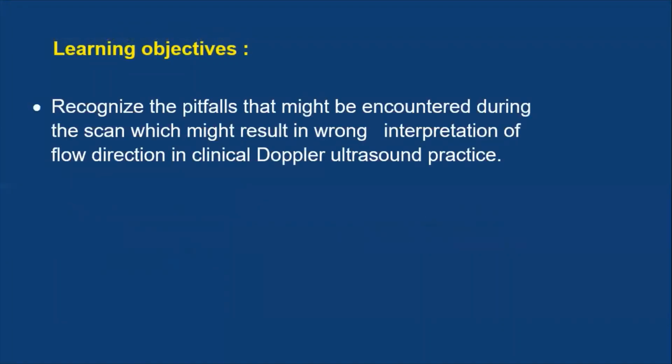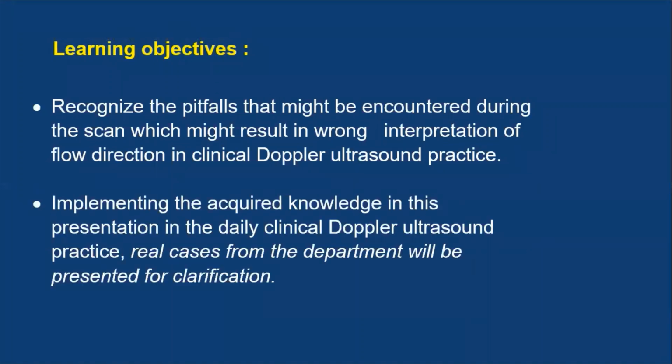As well as we will recognize the pitfalls that might be encountered during the scan, which might result in a wrong interpretation of flow direction in clinical Doppler ultrasound practice. And we will implement all this acquired knowledge in the daily clinical Doppler ultrasound practice.